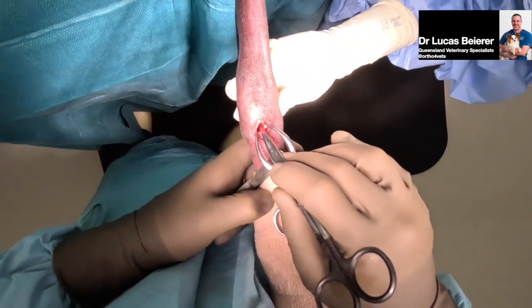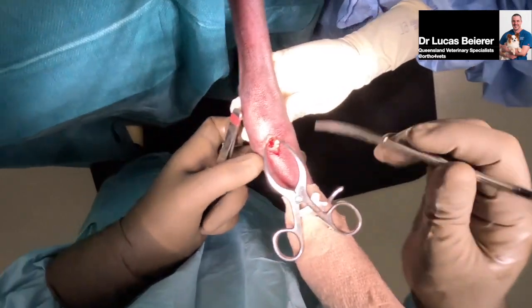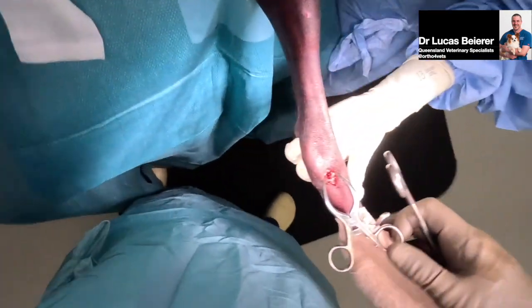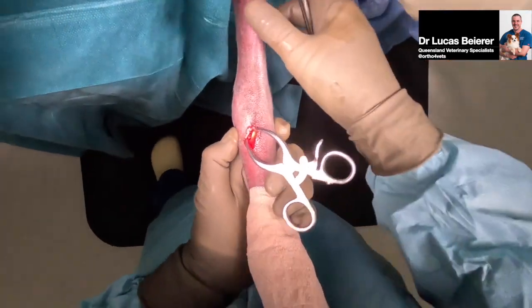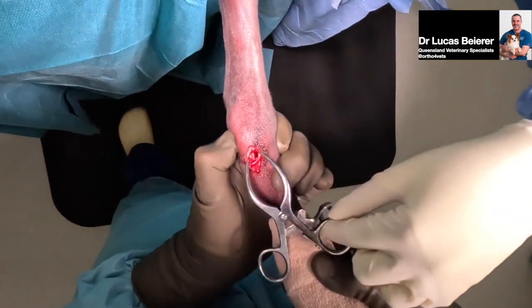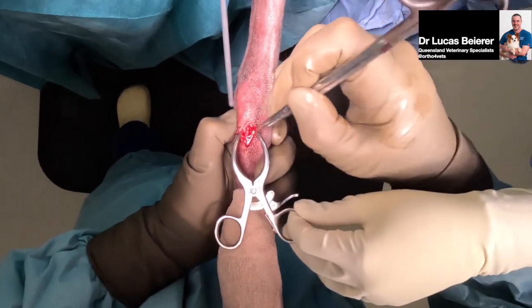So you can see there the base of the talus. So that's our bones popped out sideways. There's the comminution in through there, so we'll need to try and reduce that manually. So a bit of traction. Yeah, just hold that stitch. And so you can see that bone with a little bit of traction's coming into play.